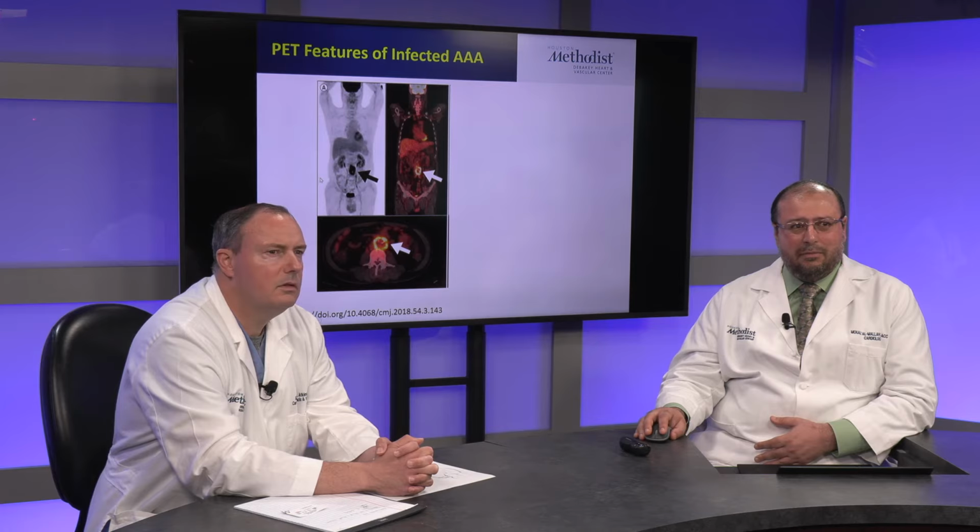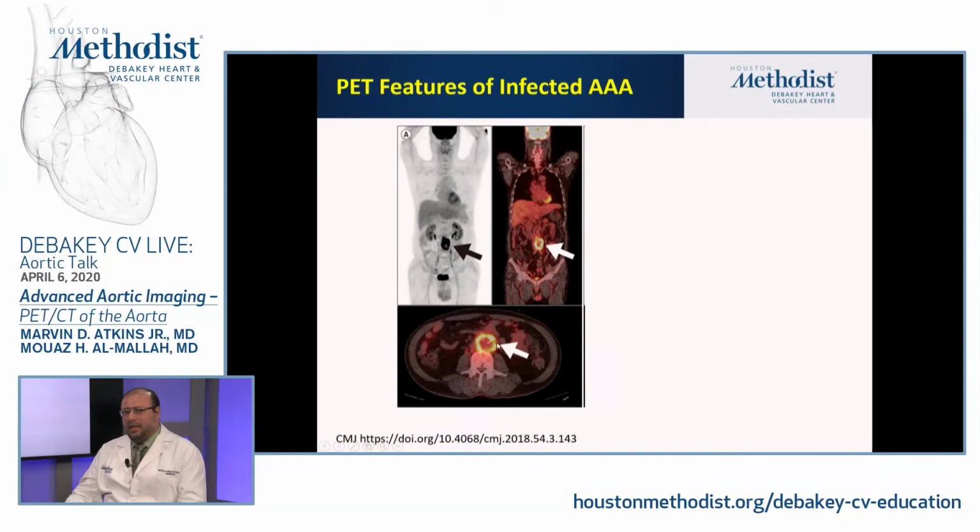So this is, for example, a patient, also from the literature, with an abdominal aortic aneurysm, which eventually got infected. Now one common challenge is how do we differentiate between inflammation versus infection? Usually infection has way more white blood cells. Inflammation from atherosclerosis and others will have less. But if you talk about differentiating giant cell or Takayasu type of inflammation, where it's very intense, versus a mild infection, this is where we have some overlap or issues.